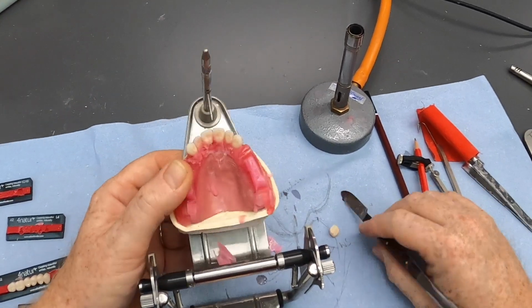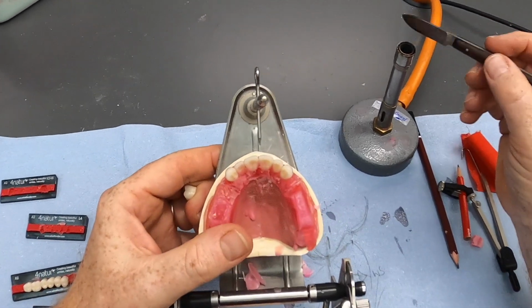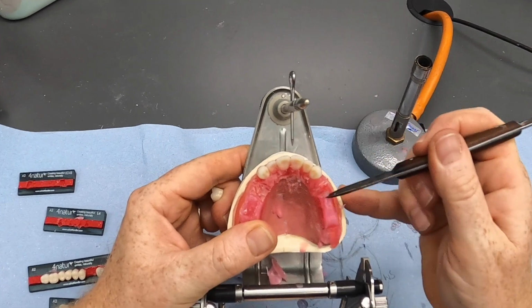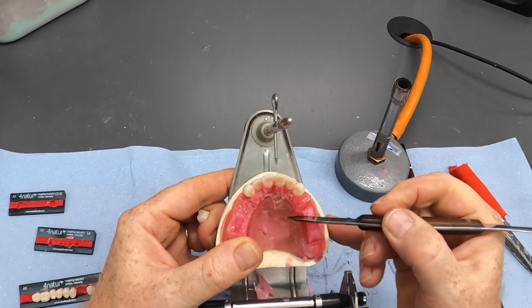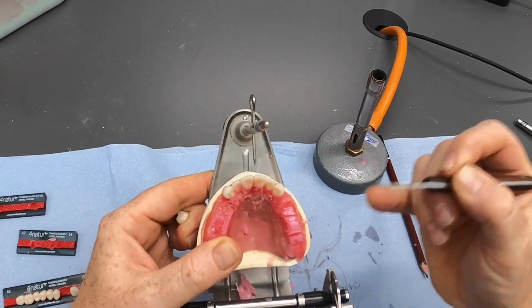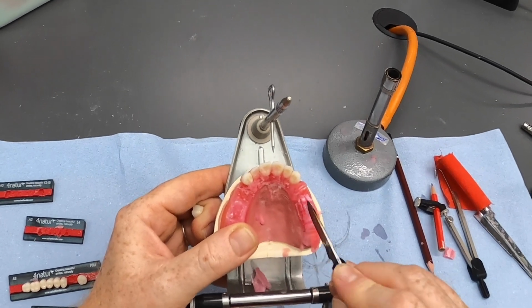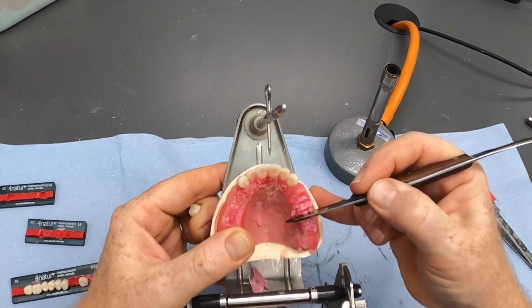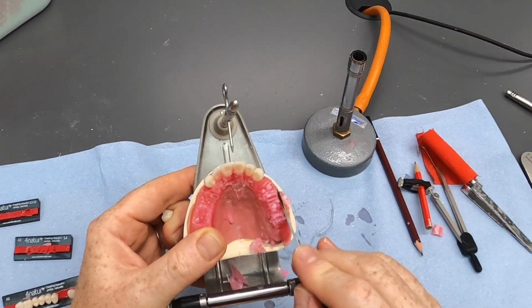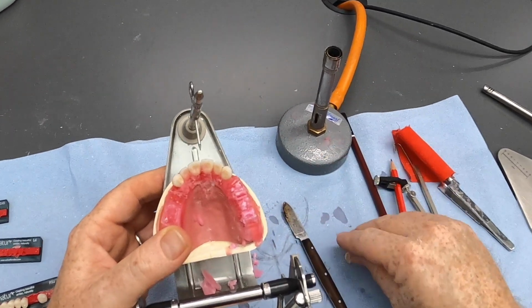So of course we're giving preference to the position of the lower 6. The upper 6 might be slightly buccal to the alveolar ridge, might be on the alveolar ridge, or very slightly palatal in some cases. It's not quite as critical for the upper tooth because we've got a lot more support for the upper denture, because we've got the hard alveolar, and it's typically hard, sometimes we have some fibrous tissue on top of it, but typically it's hard, and of course we've got the palate.